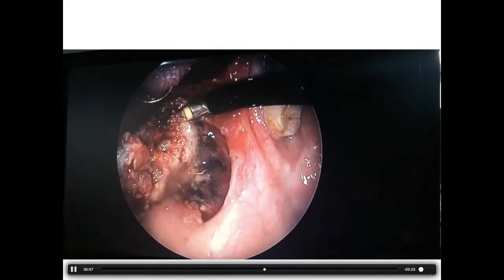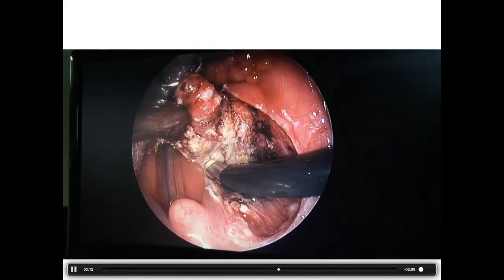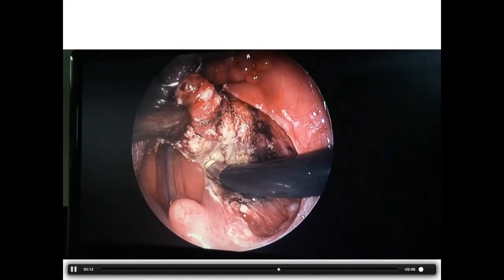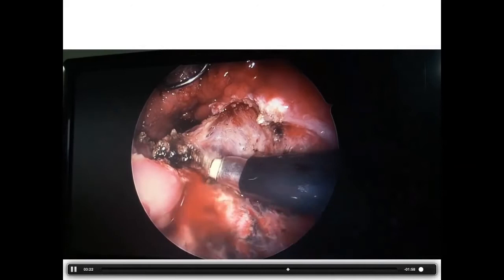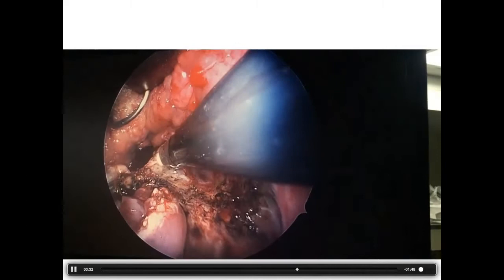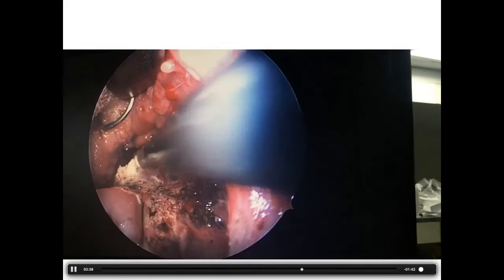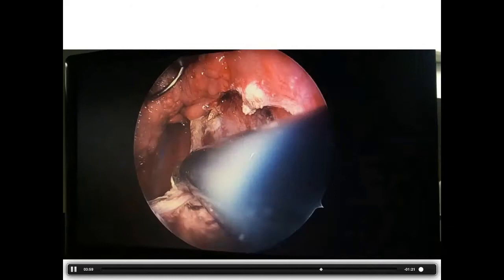That is why you see more black spots compared to tonsillectomy. We identified the entire extent of the lesion — the tonsillar artery was not encountered so we just ablated the venous blood supply. We were able to excise the lesion in total and achieved complete hemostasis.